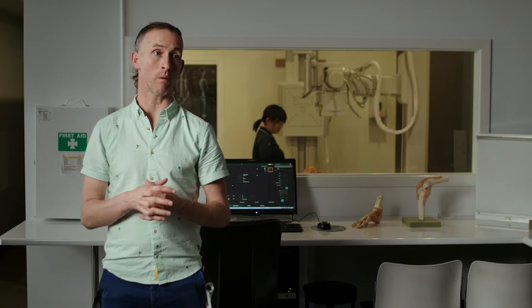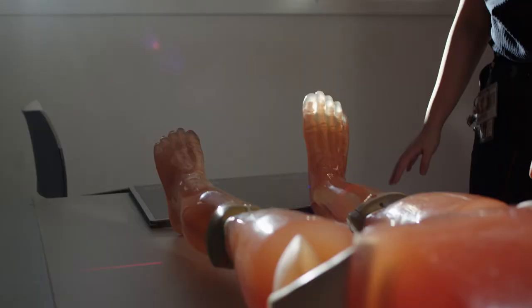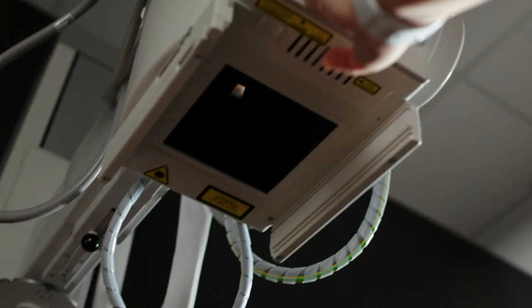A leg x-ray is probably one of the most straightforward examinations to perform, and I think the easiest way to perform that is to have the patient just lying flat on their back with their leg stretched out straight, and we just roll it into the different positions that we need for the diagnostic image.